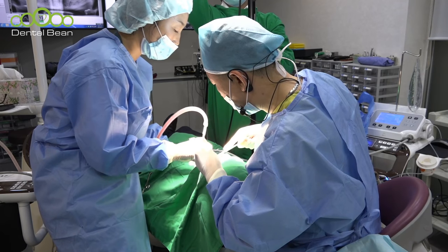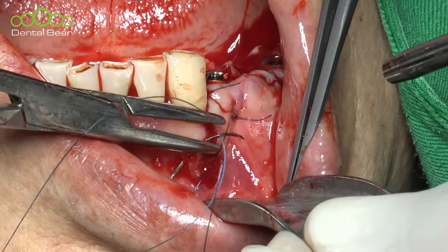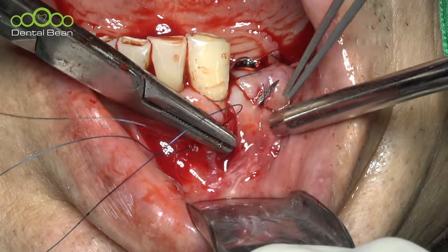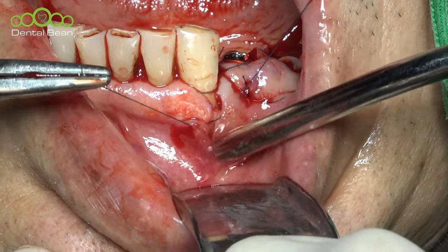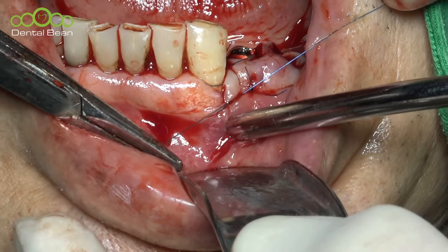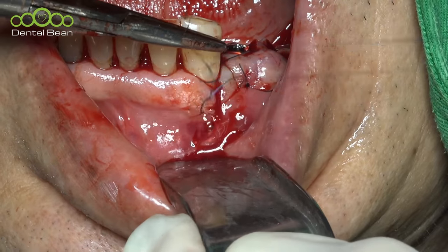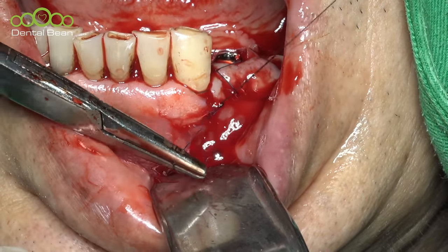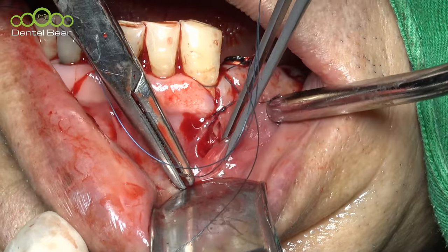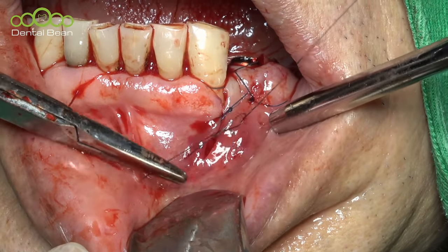First one, usually mucogingival junction first. At the time of the vertical incision suturing, please be careful. Meticulous force control is necessary. Right here. And the lower side. This is the movable labial mucosa. Just a simple interrupted suture.